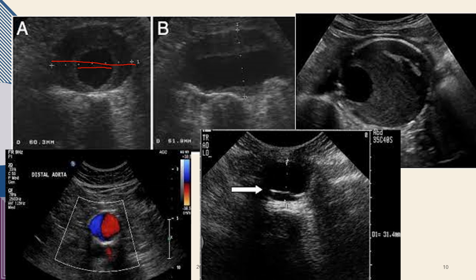So here, because the sonographer or sonologist has their settings set appropriately, you can see that these low-level echoes would indicate that there is some thrombus within that lumen. Again, the measurement indicates that there is overall dilatation, and then that this is the open lumen. So that's a patient again with a AAA with thrombus.